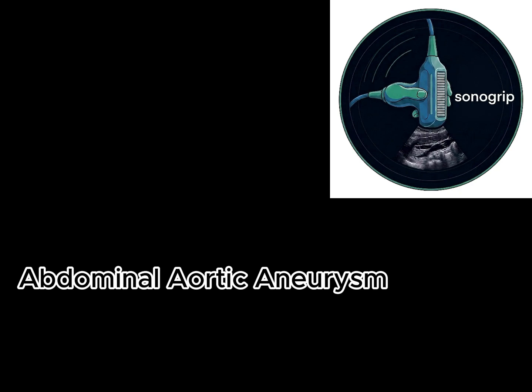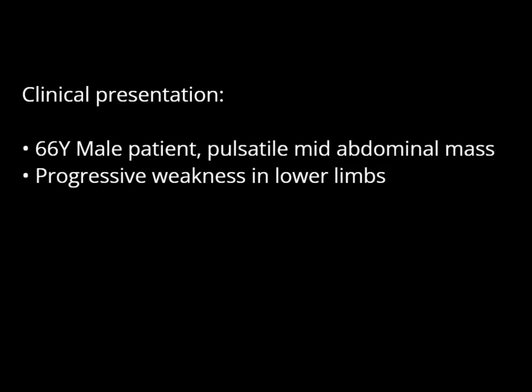Today we will discuss the most critical and life-saving scan, which is abdominal aortic aneurysm. A 66-year-old male patient presents with a pulsatile mid-abdominal mass and progressive weakness of the lower limbs. So let's get started and see what we got.